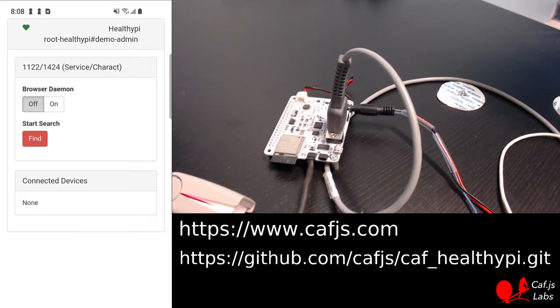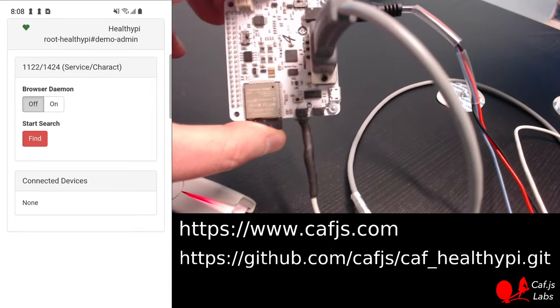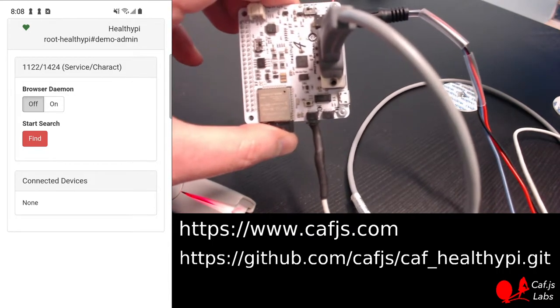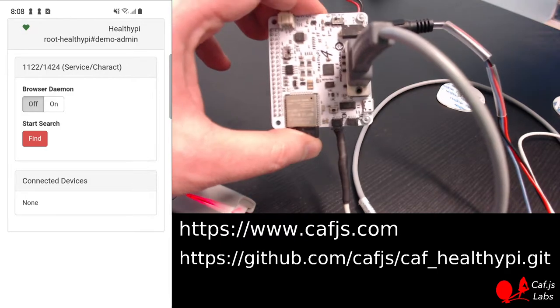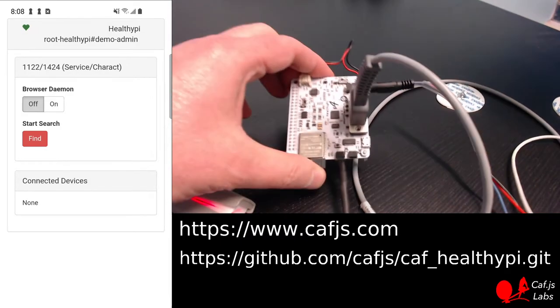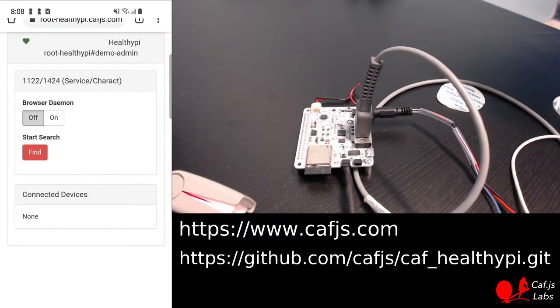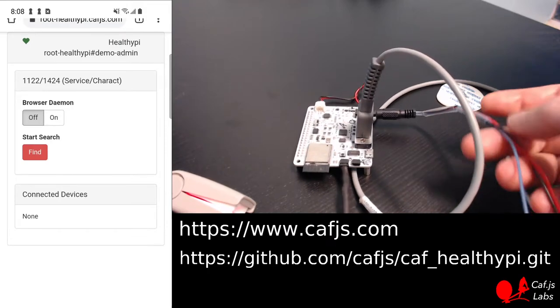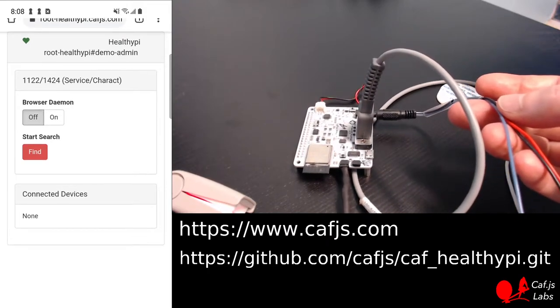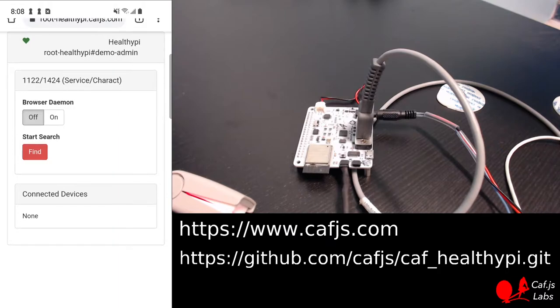It uses a Healthy Pi, a cheap device that provides basic vital signs through a Bluetooth interface. I have connected to my body these three electrodes, so you are going to see my heart in action in a moment.